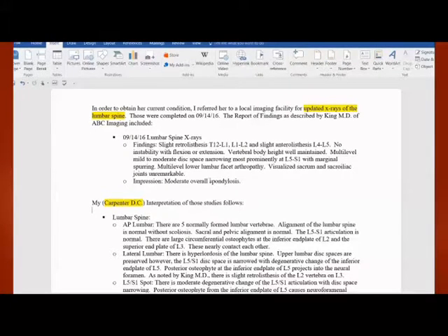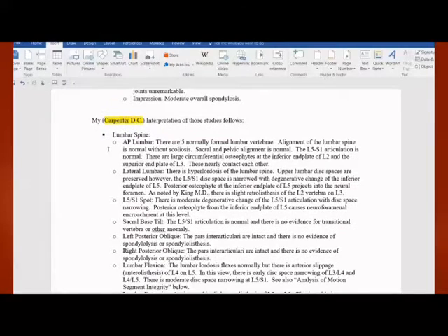So I called the medical radiologist back up and asked him to take another look at the images and to tell me whether or not, in his opinion, he identified a cervical rib, and he did. He agreed, and he provided an addendum to the X-ray report. So always, always, always provide your own interpretation of the X-ray studies.